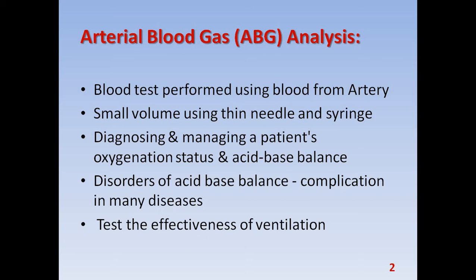A small amount of blood is required and it is taken using thin needles and syringes. It is used for diagnosing and managing patients' oxygen status and acid-base balance. The disorders of acid-base balance can cause serious complications in case of many diseases.